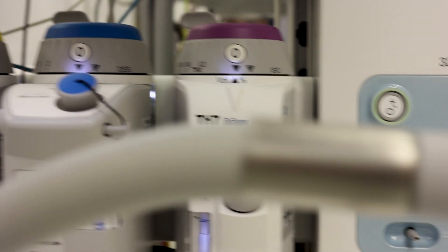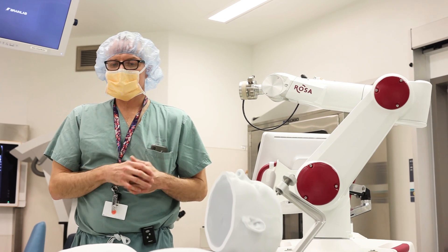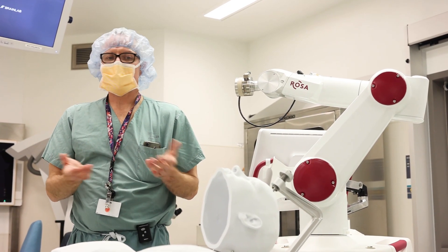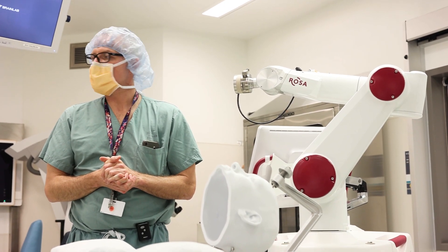It takes a while for things to catch on, and for people to have data to show that this is safe. Now, because it was used for many years mostly in Europe, there is a lot of data showing that the complication risk of this procedure is very low — actually lower than the other subdural grid type procedure.